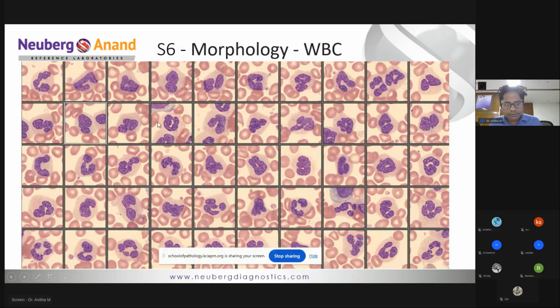Now when we look at these kind of neutrophils, as said, this may be confused with what an MDS neutrophil can look like, but these are definitely these kind of neutrophils. If you go back and see any of your diagnosed CML cases, you'll have a lot of abnormal segmentation, which is a part of a myeloproliferative neoplasm itself and need not have an additional MDS component.